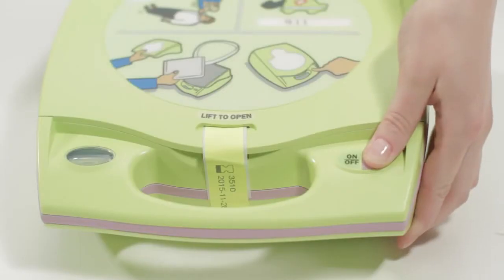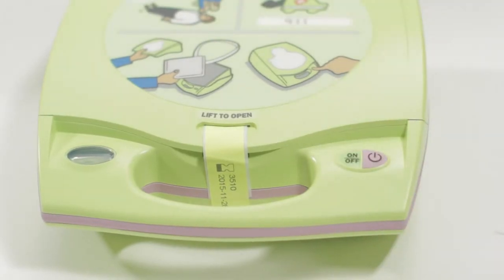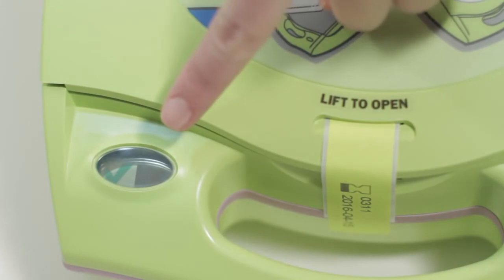Complete your inspection by performing a manual self-test like the one we just did by holding down the on-off button for about 5 seconds. When the test is complete, the AED will say, Unit OK. The status window will display a green check mark.